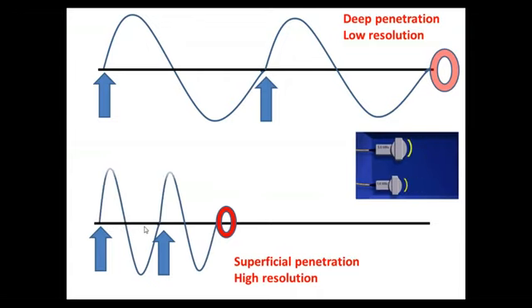Ultrasound is composed of waves, and the shorter the wavelength, the higher the frequency, and better penetration of superficial structure, or better high resolution and good assessment of superficial structure compared to low frequency with longer wavelength, which is needed more in adults or to evaluate deeper structure at the expense of resolution.